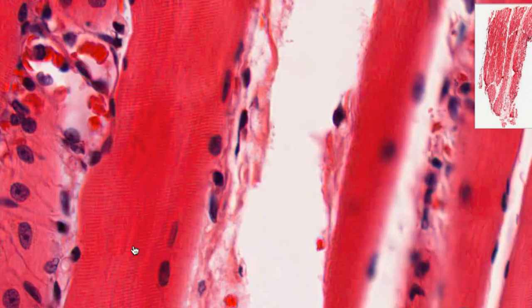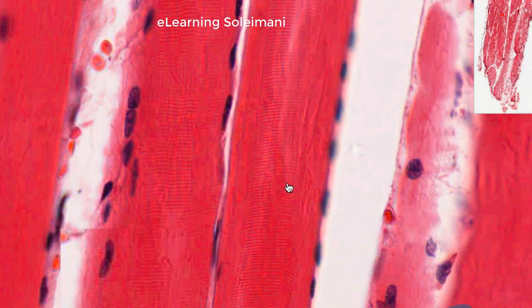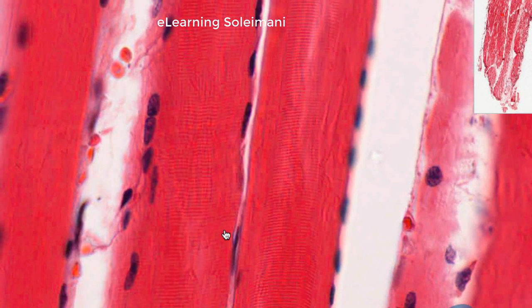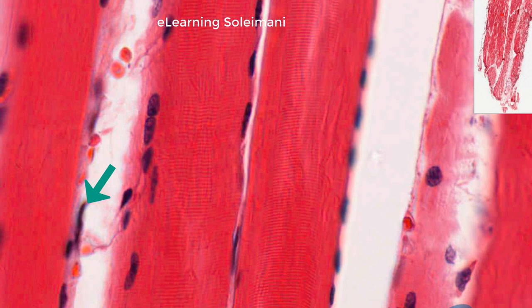Skeletal muscle cells have multiple nuclei, and these nuclei are located right beneath the cell membrane. The nuclei of fibroblast cells are also visible between the muscle fibers.